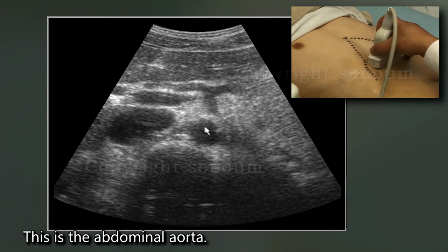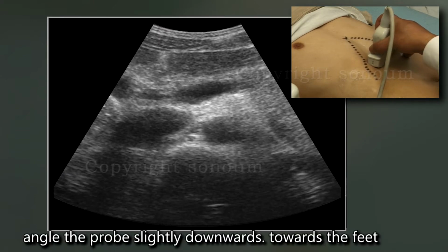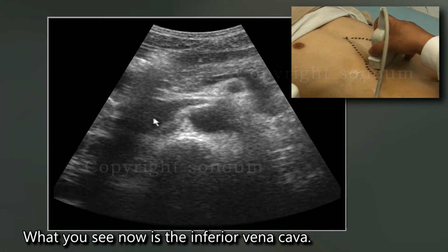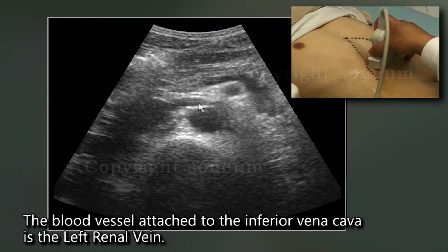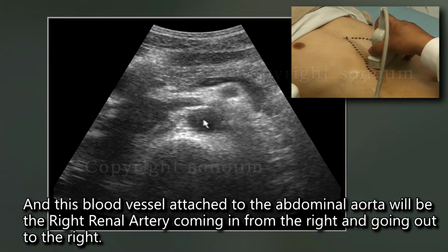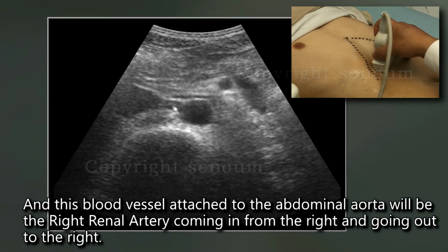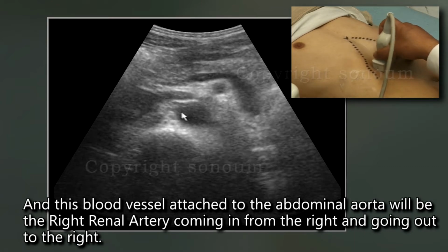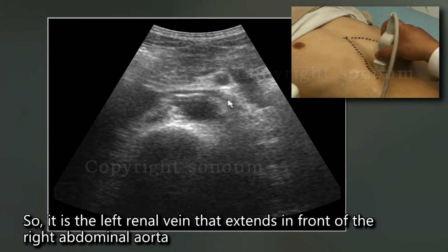Now in the image, this is the abdominal aorta. This is the inferior vena cava. So, to see the anatomy around this area, angle the probe slightly downwards towards the feet. What you see now is the inferior vena cava. The blood vessel attached to the inferior vena cava is the left renal vein. And this blood vessel attached to the abdominal aorta will be the right renal artery, coming in from the right and going out to the right. So, it is the left renal vein that extends in front of the abdominal aorta.